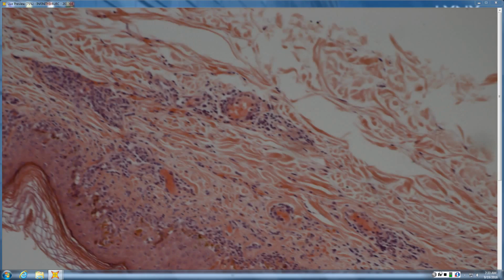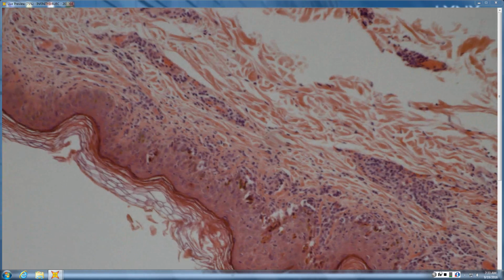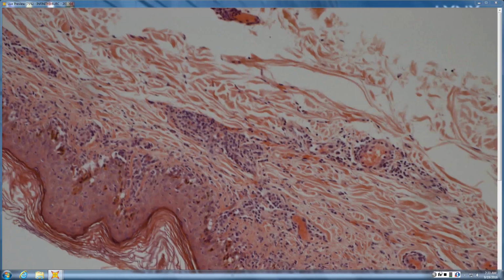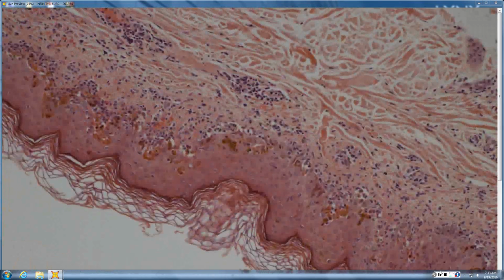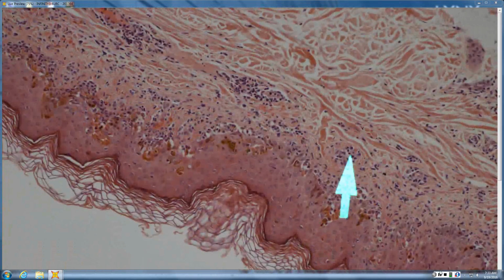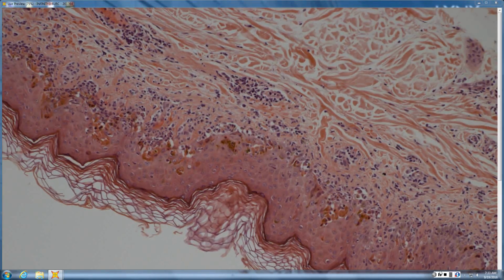Okay, Jessica. So this looks more like vacuolar change, I believe. So your basal layer probably isn't wiped out with squamatization, but do you see necrotic keratinocytes? I do. You see lots of necrotic keratinocytes, right? Yes. And what's the time course of this eruption? Well, it looks very acute because the horn looks very normal. So the horn is completely normal basket weave, so it's probably pretty acute.